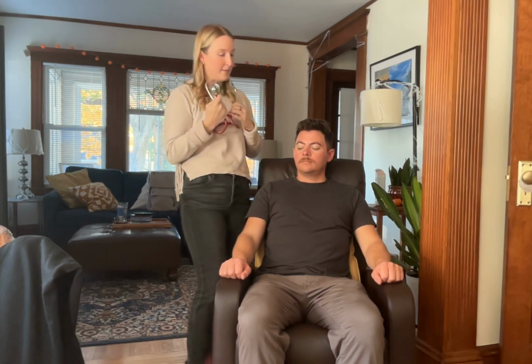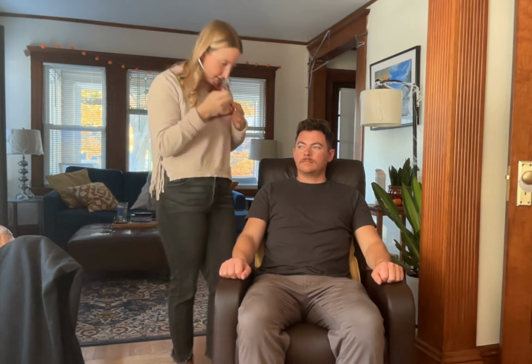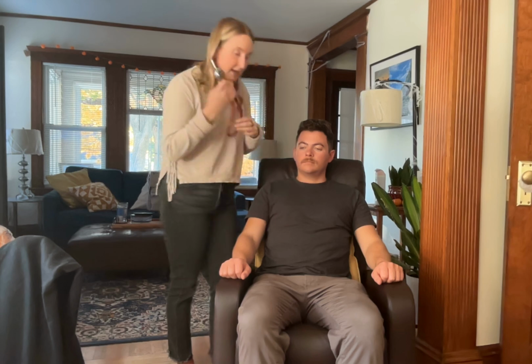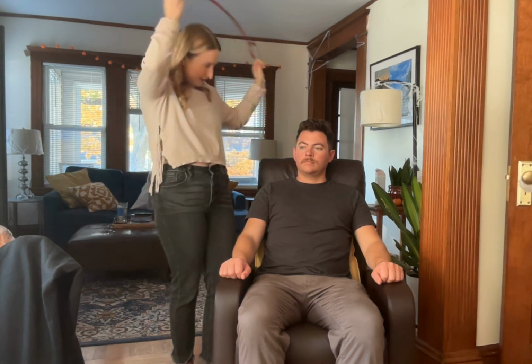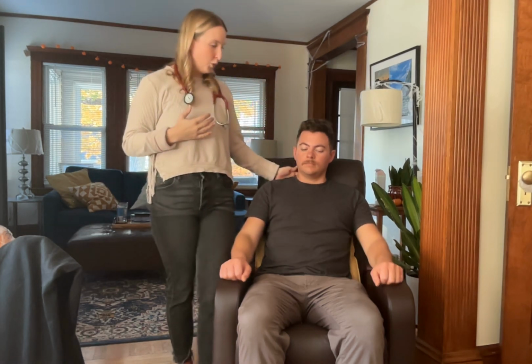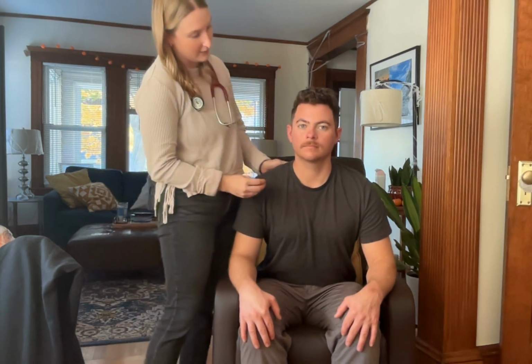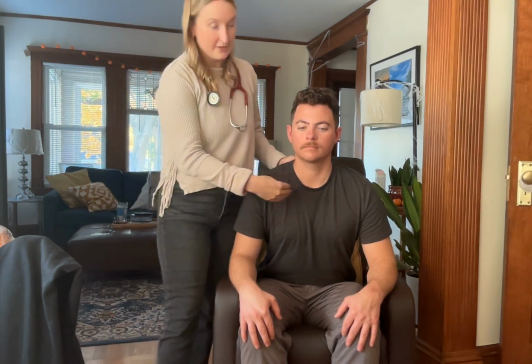I will then listen at the lower right sternal margin to hear for right-sided murmurs. And I would listen with both the diaphragm and the bell. Finally, I'd have the patient lean forward to bring the heart closer to the chest wall, and I would once again listen to all of those heart regions that I just identified with both the diaphragm and the bell.